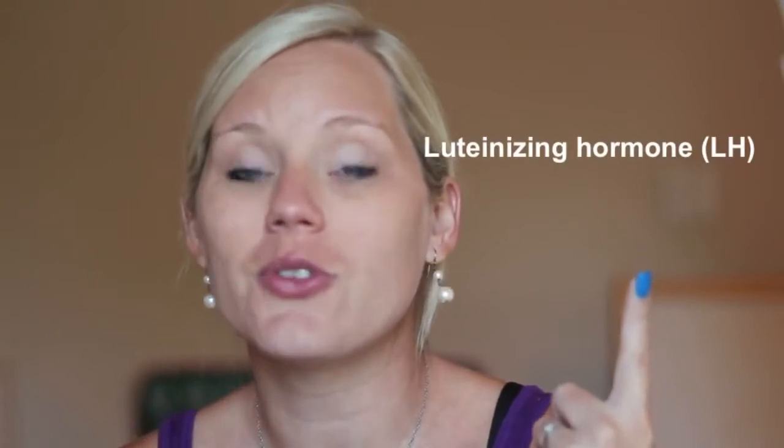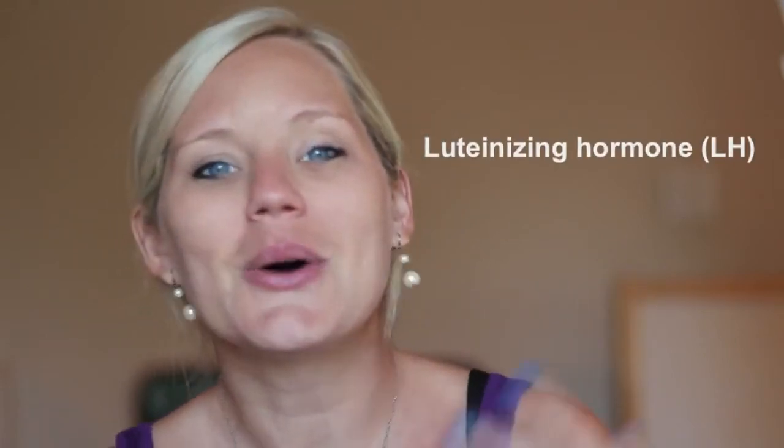If you want to understand the behind the scenes of ovulation tests and how they work, if you're familiar with pregnancy tests, then this will help you understand. When you're testing for pregnancy using a pregnancy test, your urine will have a hormone in it called HCG, and the pregnancy test is trying to detect that hormone. Well, the ovulation test works the same way, except it's a different hormone. It is looking for the LH hormone. And if you don't know what that stands for, ta-da! So this hormone, like the pregnancy one, is only there when one of the two is taking place. So HCG for pregnancy, LH for ovulation.